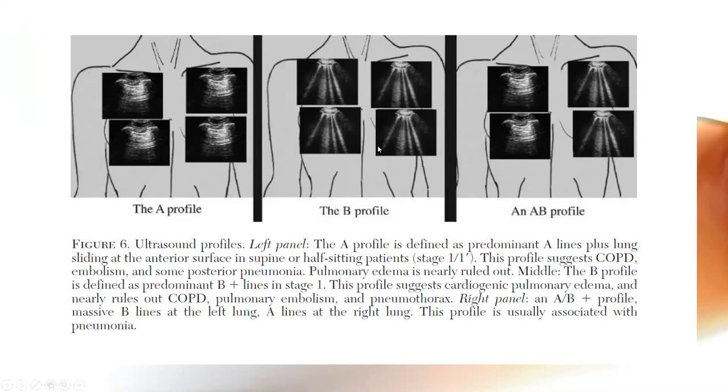B-line pattern, so this person has B-lines everywhere. So you've got B-line, B-line, B-line, and in all the different chunks of the lung, it's everywhere. So it's a diffuse process. Could it be pulmonary edema? Absolutely, 100% could be pulmonary edema. This person still could have ILD, pneumoconiosis. You've got to put that in the clinical context. So yes, obviously clinical history is very helpful.